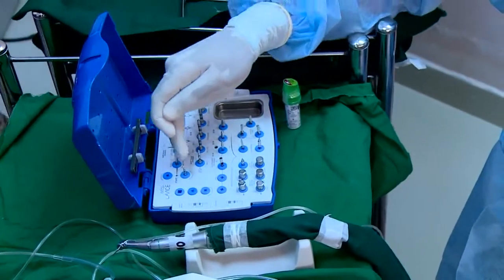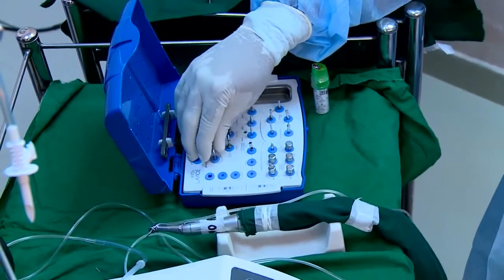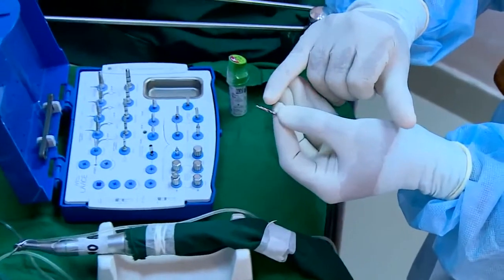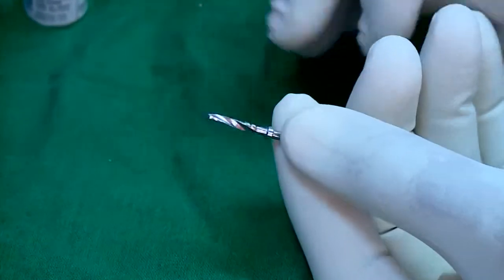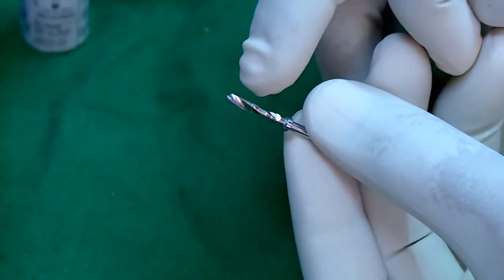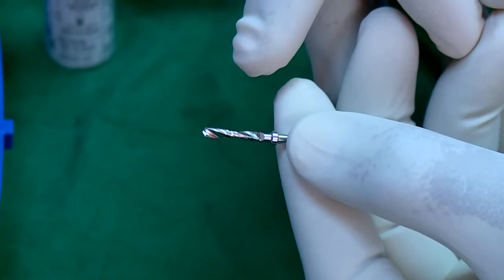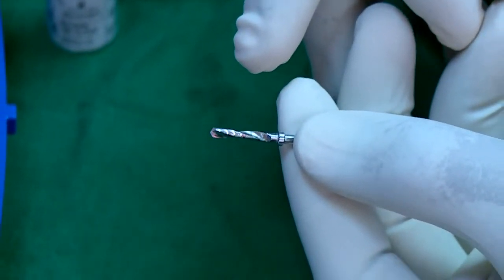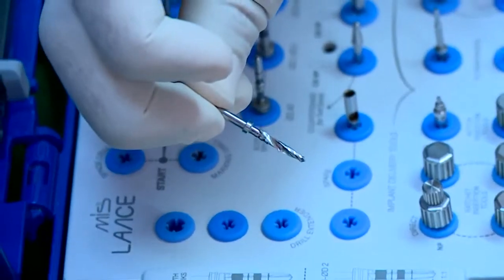Then, as I told you, we are talking about multiple drills. I will start running them and show you. Now, you can see most of these drills will have markings on them, because one of the main things about implants goes into the planning. What size of implant am I going to place, both in terms of the depth or height of the implant as well as the width of the implant.